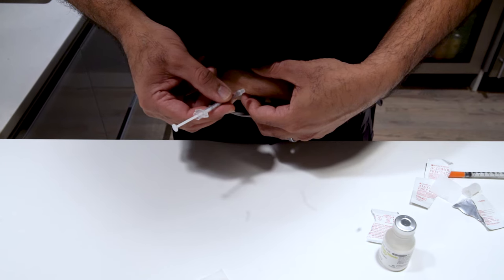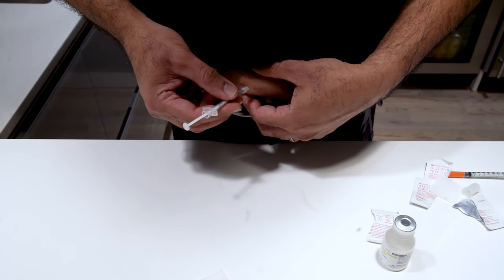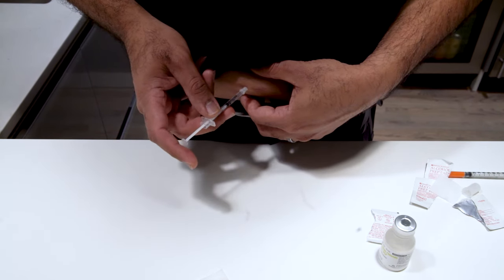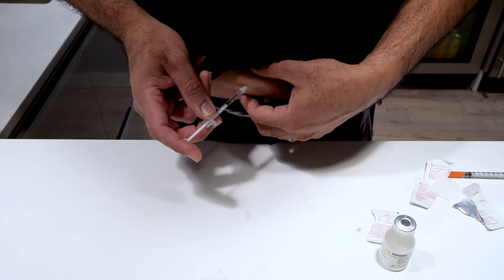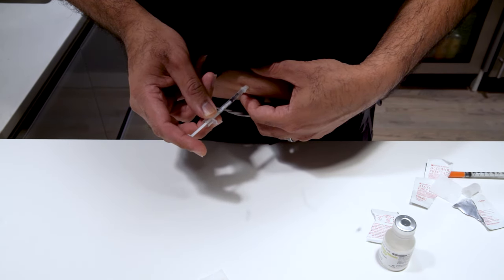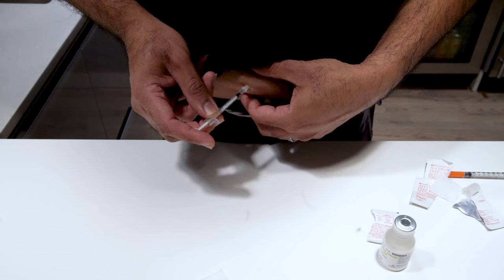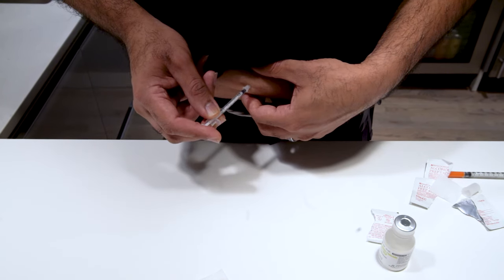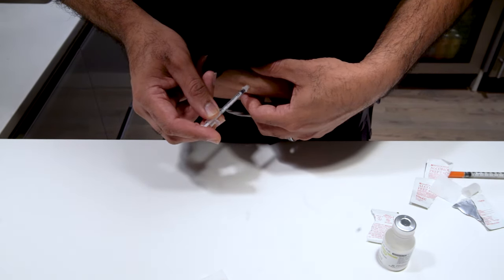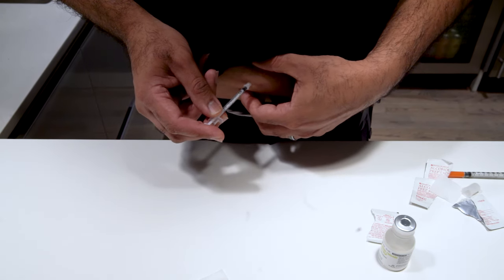You're just going to push it in. It's a very small needle. You will likely not feel it. Once it's in, I want you to go and slowly push the plunger in over the course of three seconds.